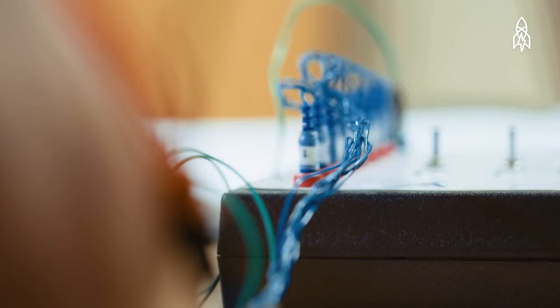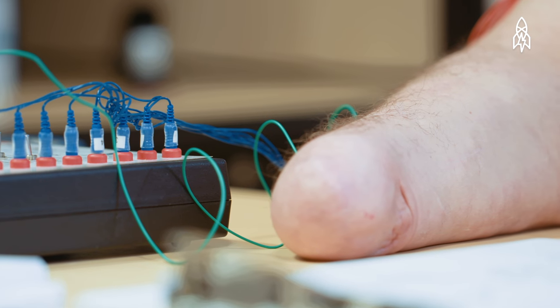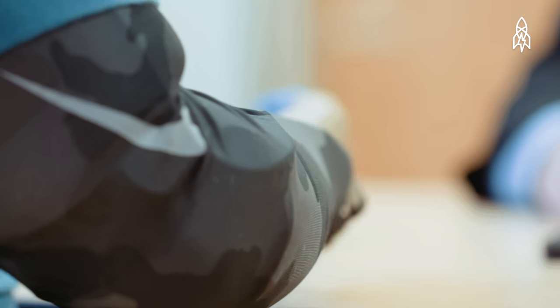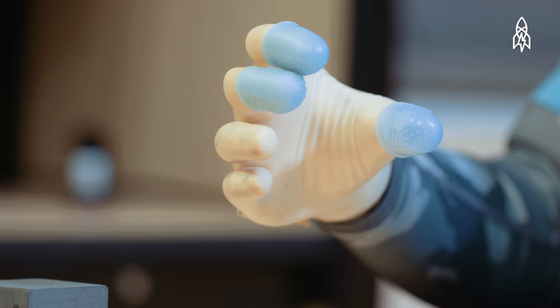They can feel not just buzzing but also a touch of pressure, like somebody putting a finger on their hand. And in fact we've been able to see that the intensity of the artificial stimulation mimics the intact hand.